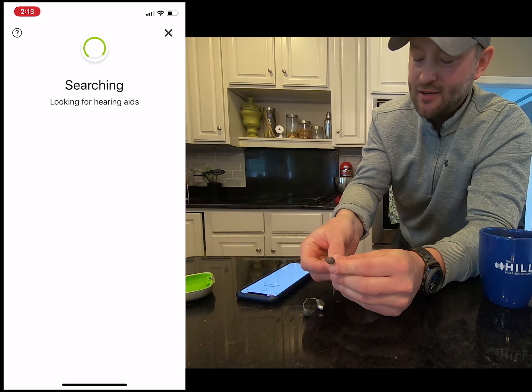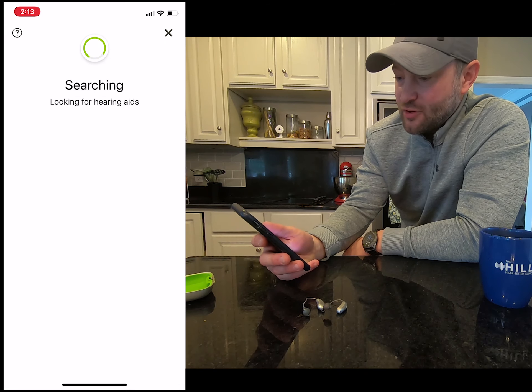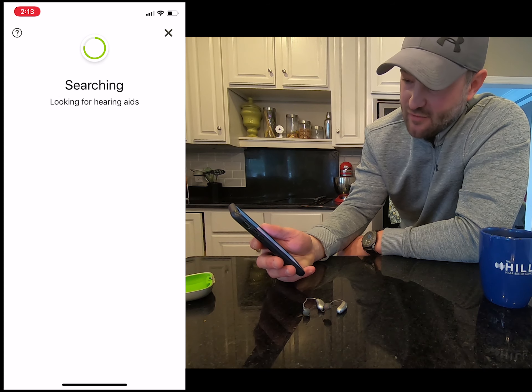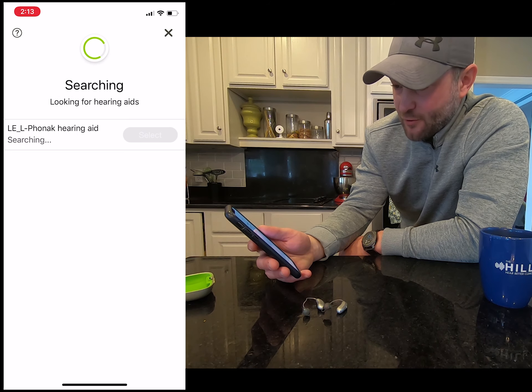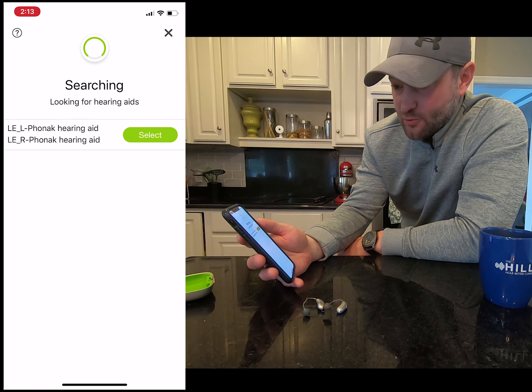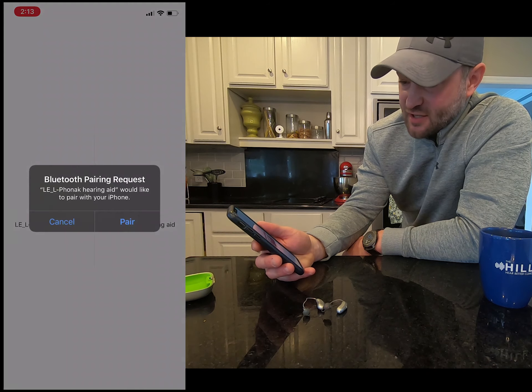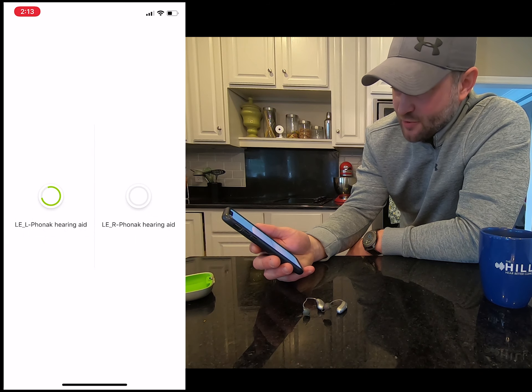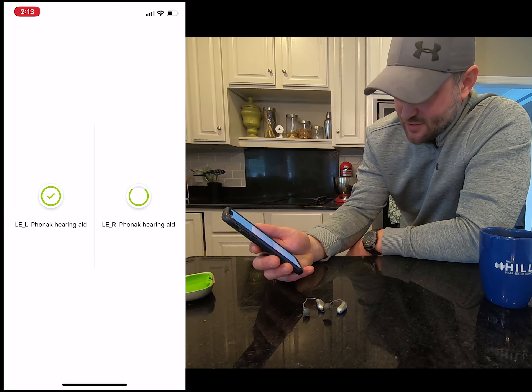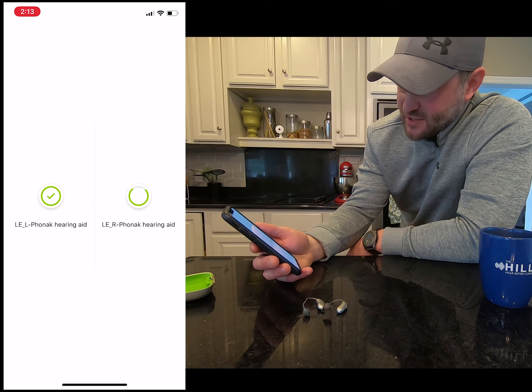Now we'll hit continue and it's looking for the hearing aid. We're going to close the battery doors on both devices — there's one, there's two — and our phone is now going to be looking for the hearing aids. We'll give it just a few minutes and it will all connect. There's the left one showing, the right one shouldn't be too far behind. For this we're going to select both. Go ahead and hit select — it'll connect the left one first and ask you to pair it. Go ahead and let it pair.